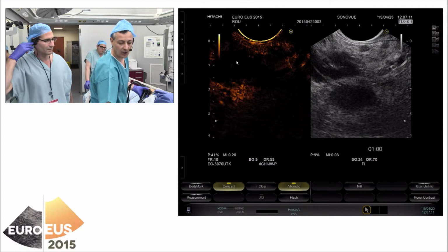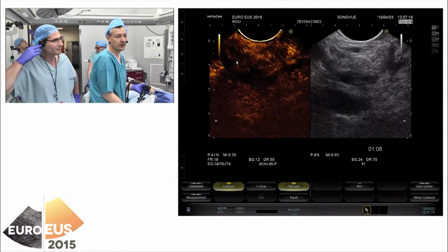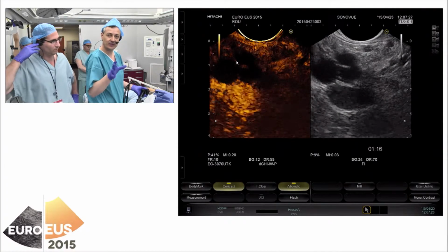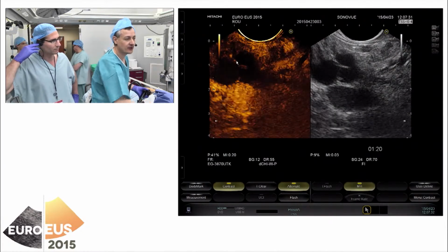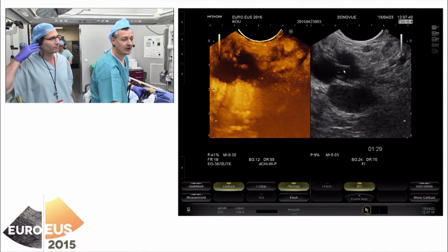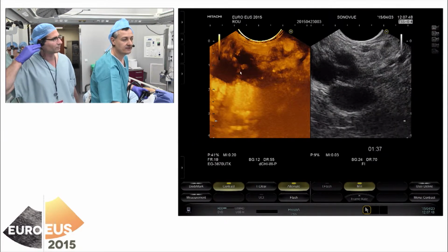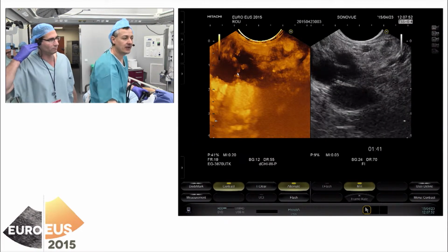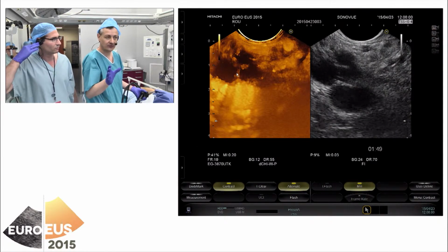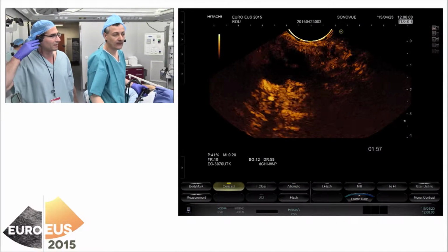Whenever you don't have a lot of signal, you can enhance it a bit. You can increase the gain a bit, but there's nothing much actually. No enhancement. This is a bit against, let's say, serous cystadenoma. Whenever dealing with a cystic lesion or a cystic neoplasm, I'll try again with the microbubble trace imaging. You see there are some faint signals here, but some of them are induced also by the hyperechoic margins of the septations. You see it better now. There is some faint signal, but I'm not sure if it's vascular or only the septations giving some echoes. But whenever you have a low signal intensity, you can use this mode, which is called microbubble trace imaging, which superimposes the images over time. So rather IPMN, maybe, in the diagnosis.